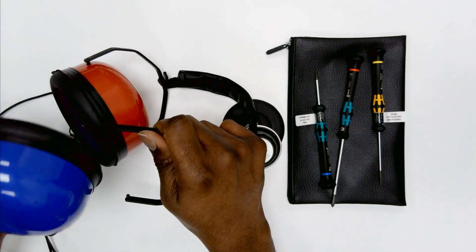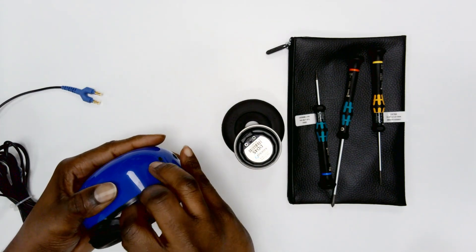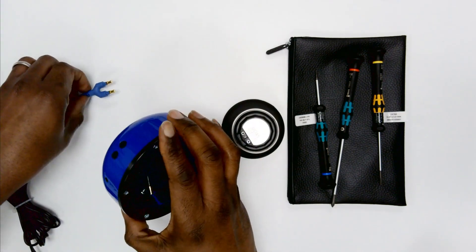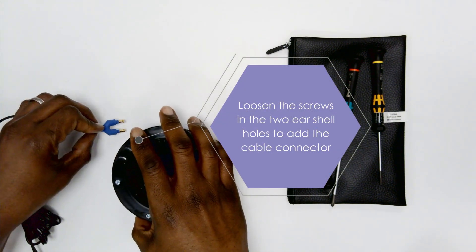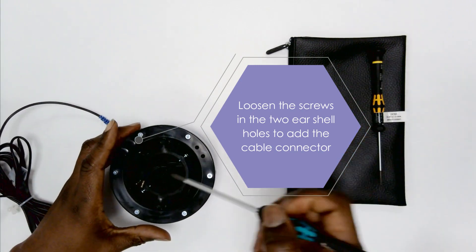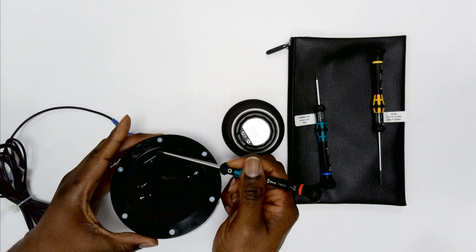First, remove the audio cup ear cushion from the corresponding ear side to the earphone you're connecting. You'll now see two holes in the ear shell which have screws that need to be loosened to allow the cable connector to be added. You may need to move the phone within the ear cup to expose the screws.